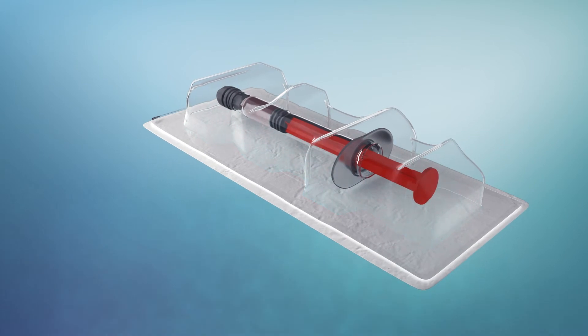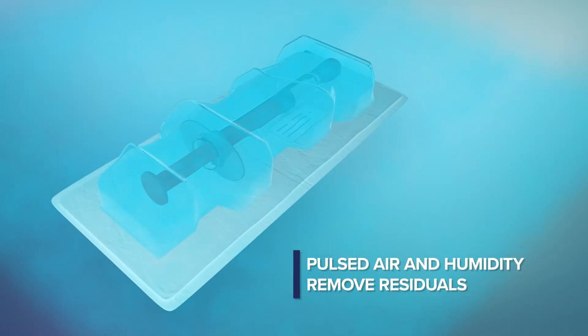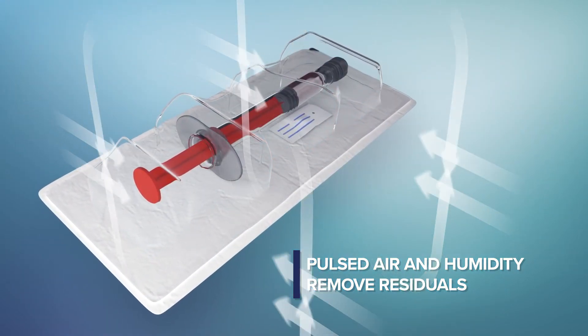VHP is removed in the post-conditioning cycle phase by vacuum and by using low-temperature water humidity and aeration pulses for best residual removal and to complete testing.